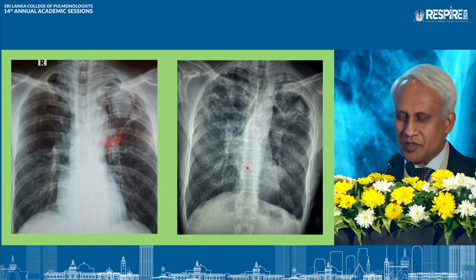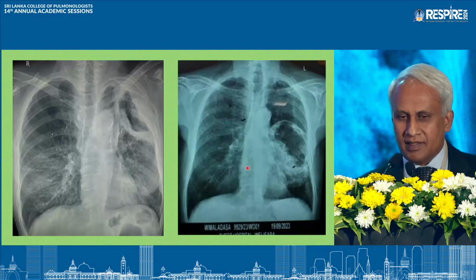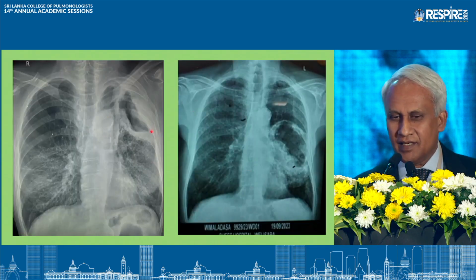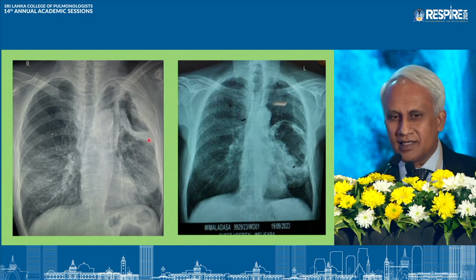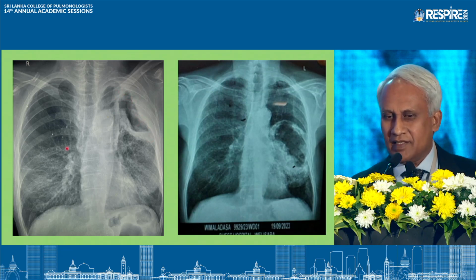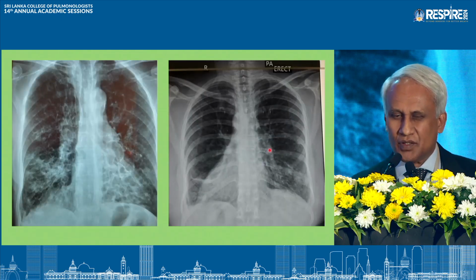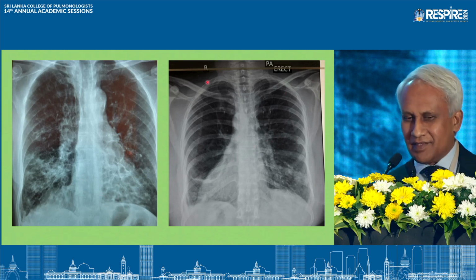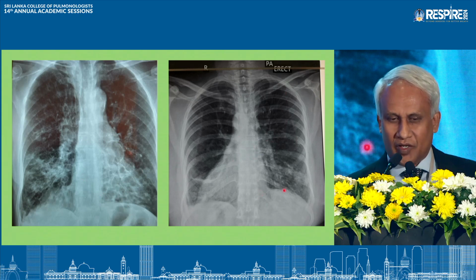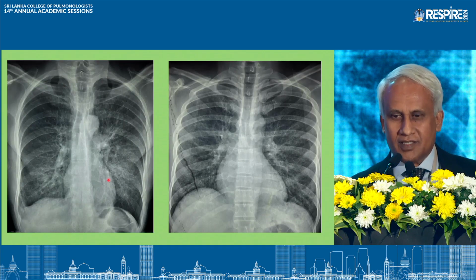Always consider other possibilities like malignancies, blood clots, everything. So this cavity and this one, you can see very irregular inside, suggesting a cavitating malignancy. Even this one is a cavitating malignancy. This is just to show you some bronchial changes. Always look at the right and left. So dextrocardia with bronchiectasis. To confirm that, you are supposed to do high resolution CT.